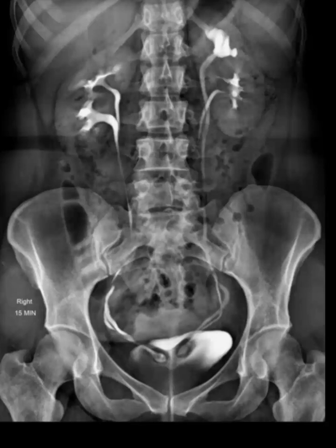Okay, so there was a scientist, it is the Weigert-Meyer rule. There are two ureters in a duplex system. The upper pole moiety of the ureter actually inserts more medially and more inferiorly. So it starts upper and is inserted downstream. The lower pole moiety is usually inserted more laterally and superiorly.